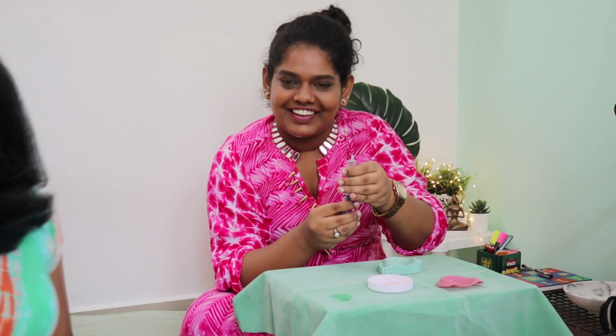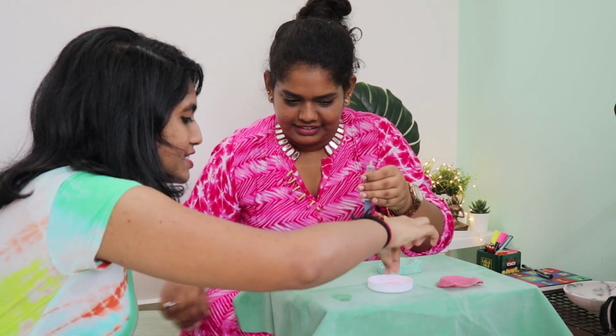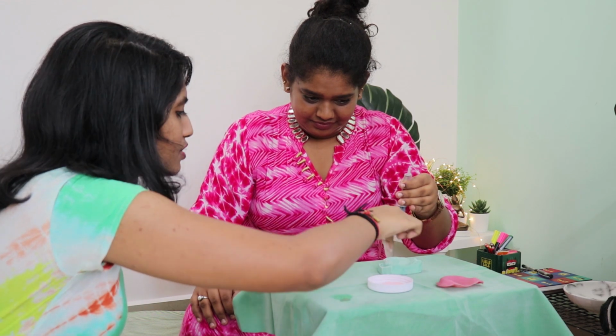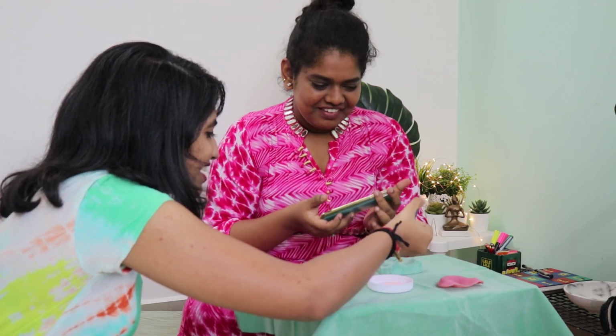Alright, okay, fine. Now what you're going to do is sprinkle this powder like this. Okay? And pour the liquid on top. But I shouldn't press the syringe, right? You should press the syringe. Wait, I'll show you one time. Nothing will happen. Okay, wait, let me do it.